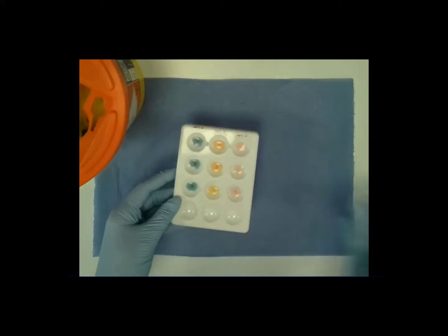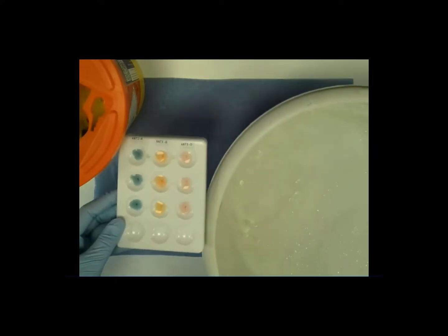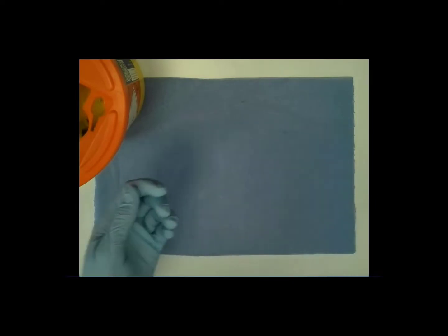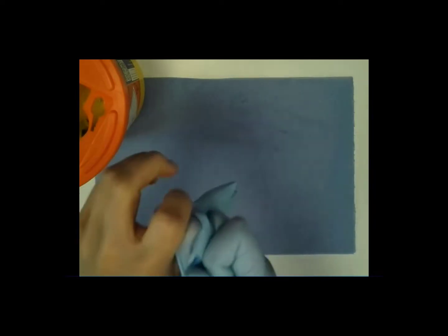After you finish with your plate, you must make sure that you dispose of it in the washing up bowl. You can then remove your gloves and place these into the clinical waste bin.